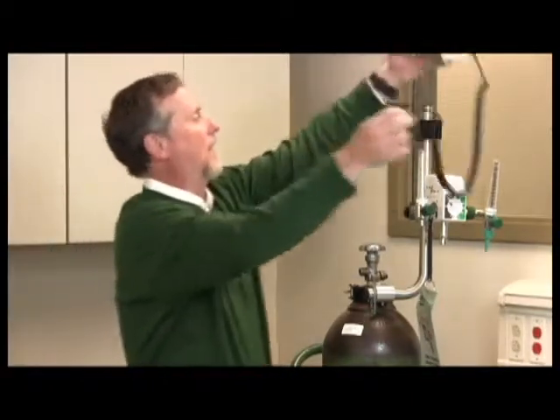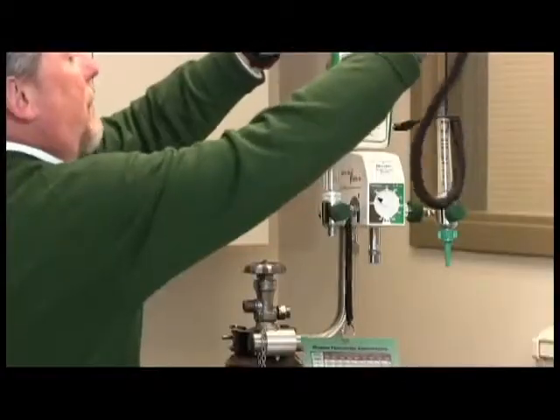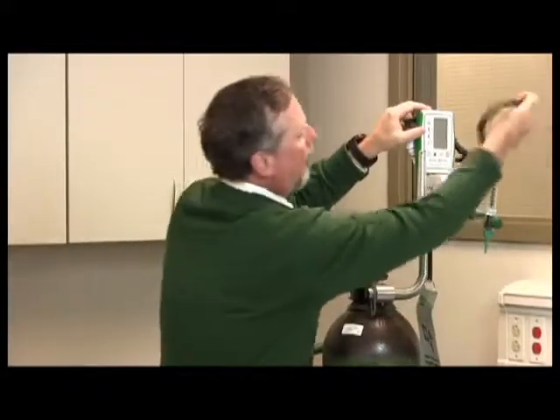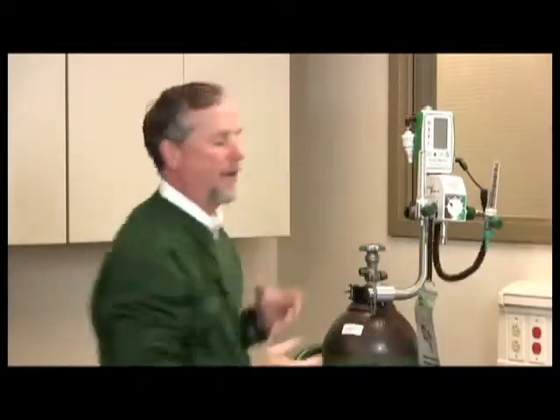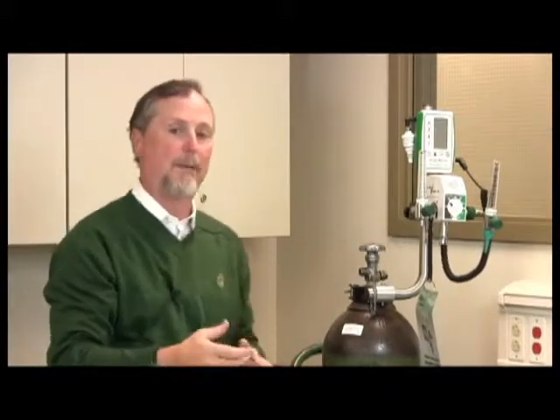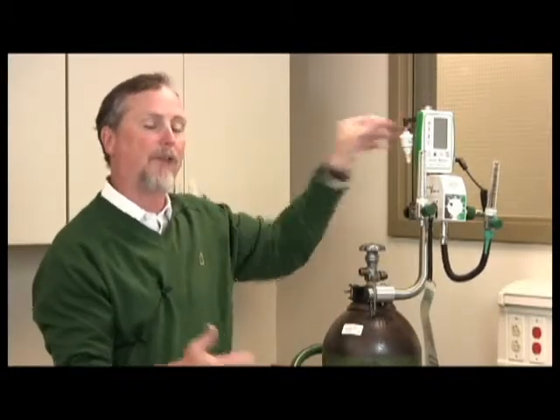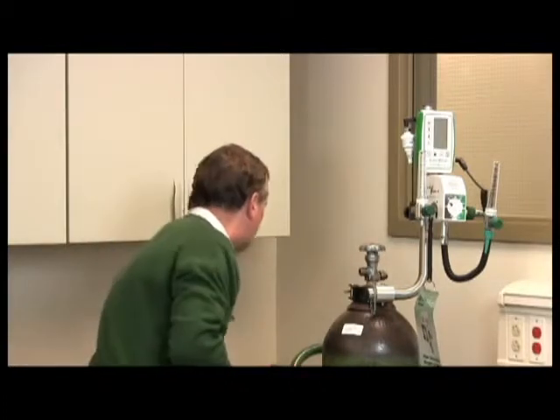We can then place our oxygen monitor in here, because we do recommend that you analyze the oxygen concentration in the monitor. This can be done on a spot check basis, depending on what device you're using, or it can be done continuously. The one thing that you want to make sure of, if there's any humidity, is that the cell on the oxygen monitor is on the dry side of the humidity, and that you don't put the cell, say, in line with an aerosol treatment or a small volume nebulizer treatment, because that back pressure will affect the accuracy of the FiO2 reading.